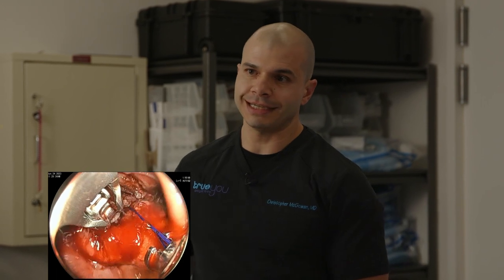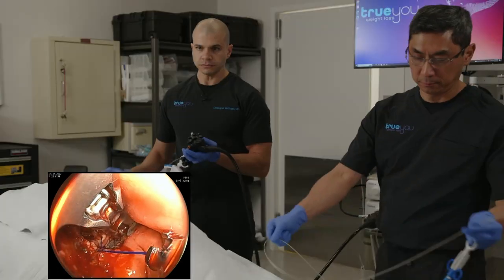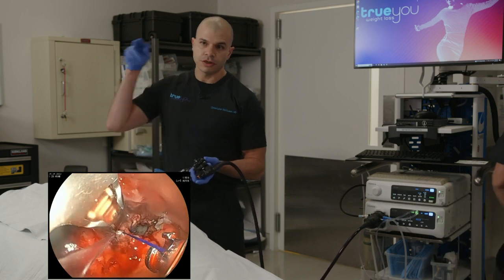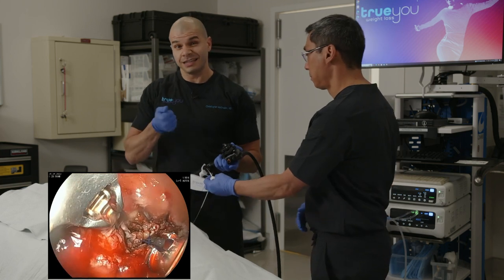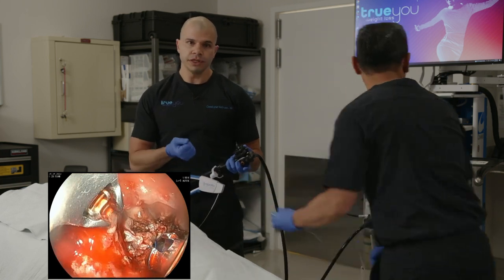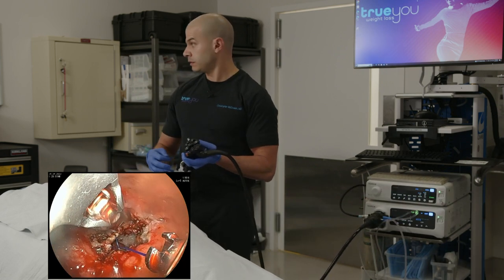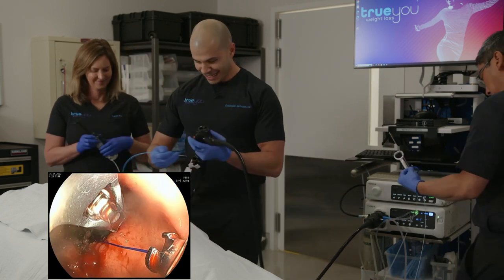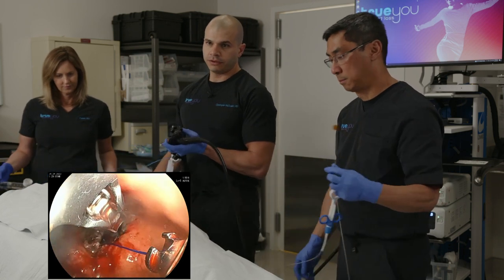But what we're going to do is tighten this over a balloon to size it. So what I'm going to do is drop my needle tip, which becomes an anchor. And we are going to load a balloon through the scope, through the outlet. We're going to inflate that to 8 millimeters, and then we will tighten. Then I can tighten the suture down all the way really tight. It will not get tighter than 8 millimeters. So Karen, our nurse Karen, thank you, has a through-the-scope balloon, which is inflated with water.